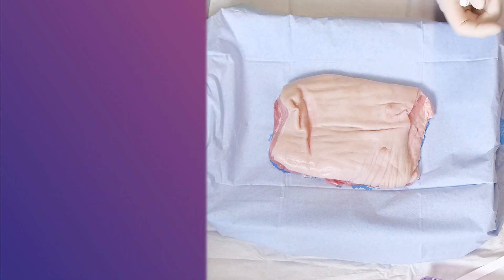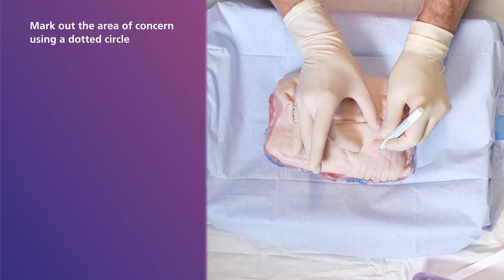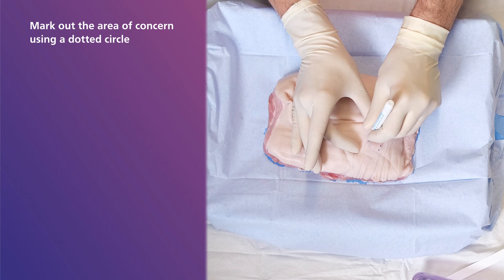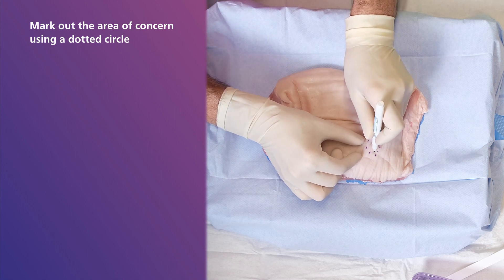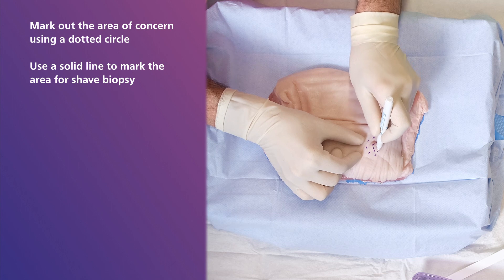Firstly, using a surgical marker, mark out the area of concern using a dotted circle. Next, using the same marker, use a solid line to mark the area for shave biopsy.